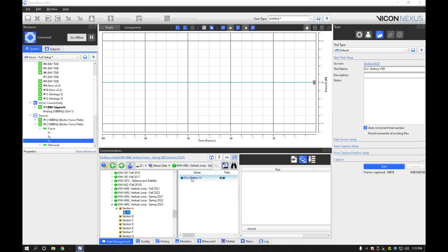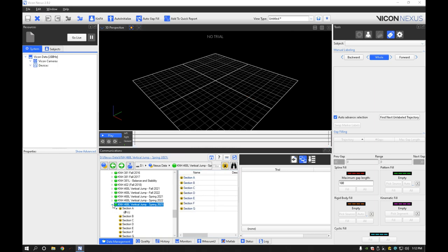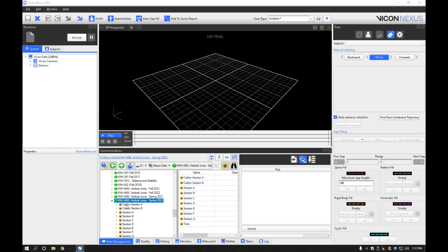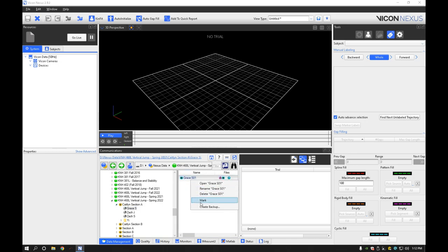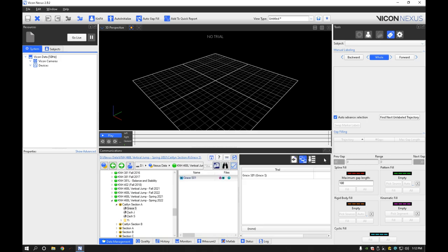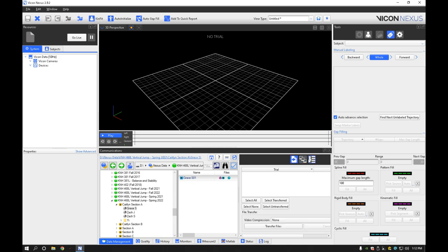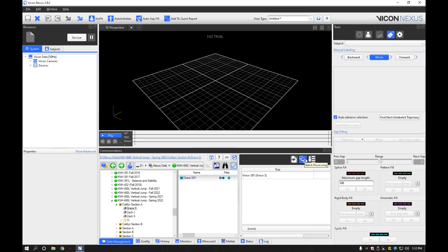So once we get all four ones, actually for this, so we have these. If you for some reason do not see this, it's just this little button right here called Show File Transfer Batch Processing to make sure you're on the middle one. If you're on any of the other ones, it will look weird, but we want the batch processing.